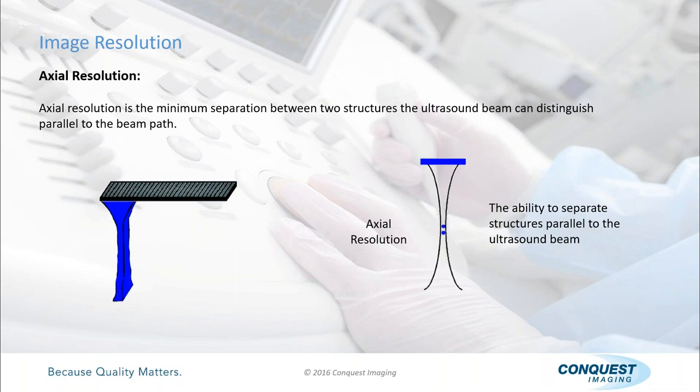Does anybody have any idea on how that would work? What would they look like? Anyone? I know some of you worked on ultrasound. Look a little bit more, not as crisp, because the further you go out, depending on the frequency of the probe, you know, the high frequencies are going to not look so great. You're going to need to switch over to a lower frequency. Lower if you need to go deeper to get to them, right? Higher if you want better resolution. So it's kind of a trade-off.